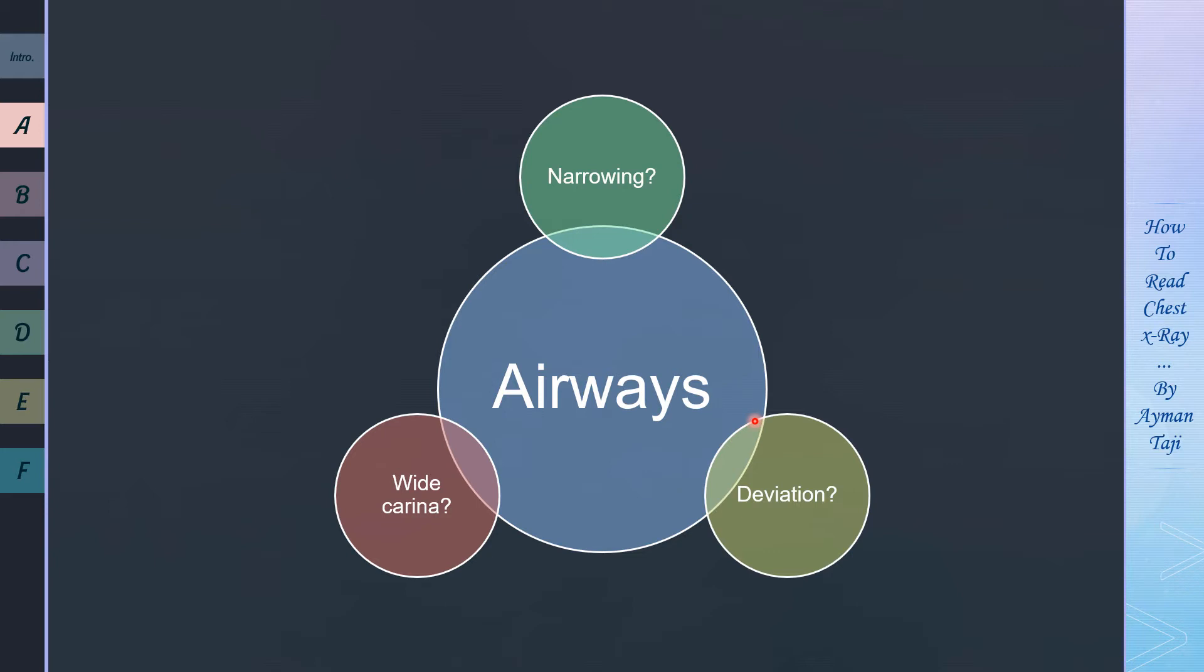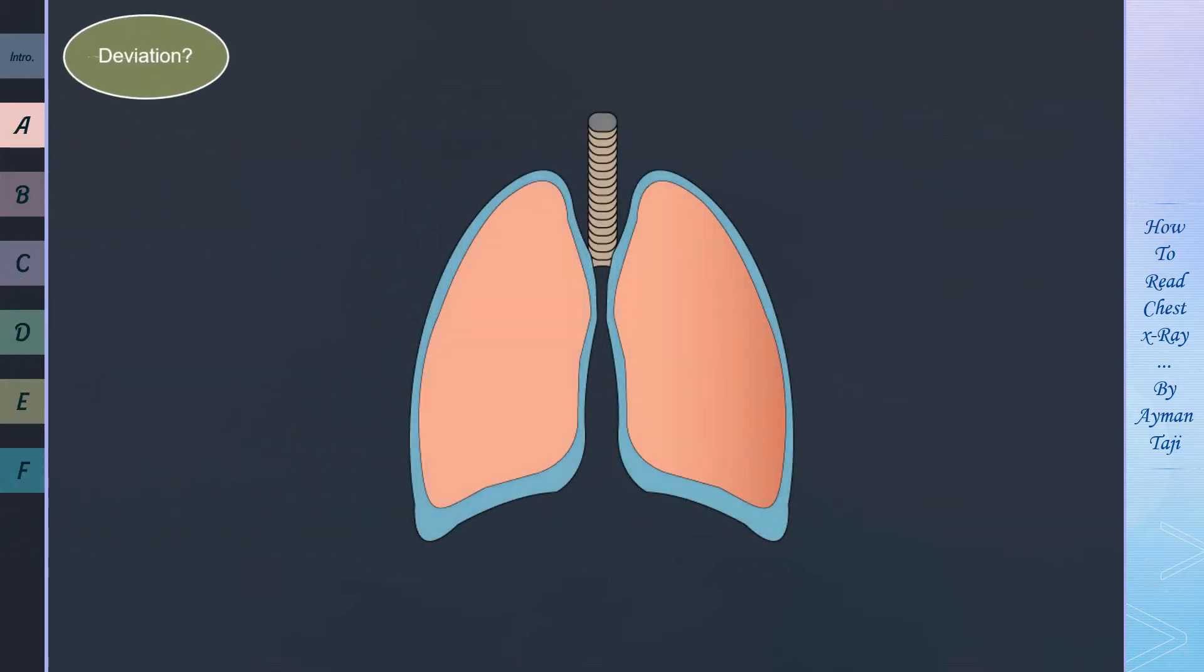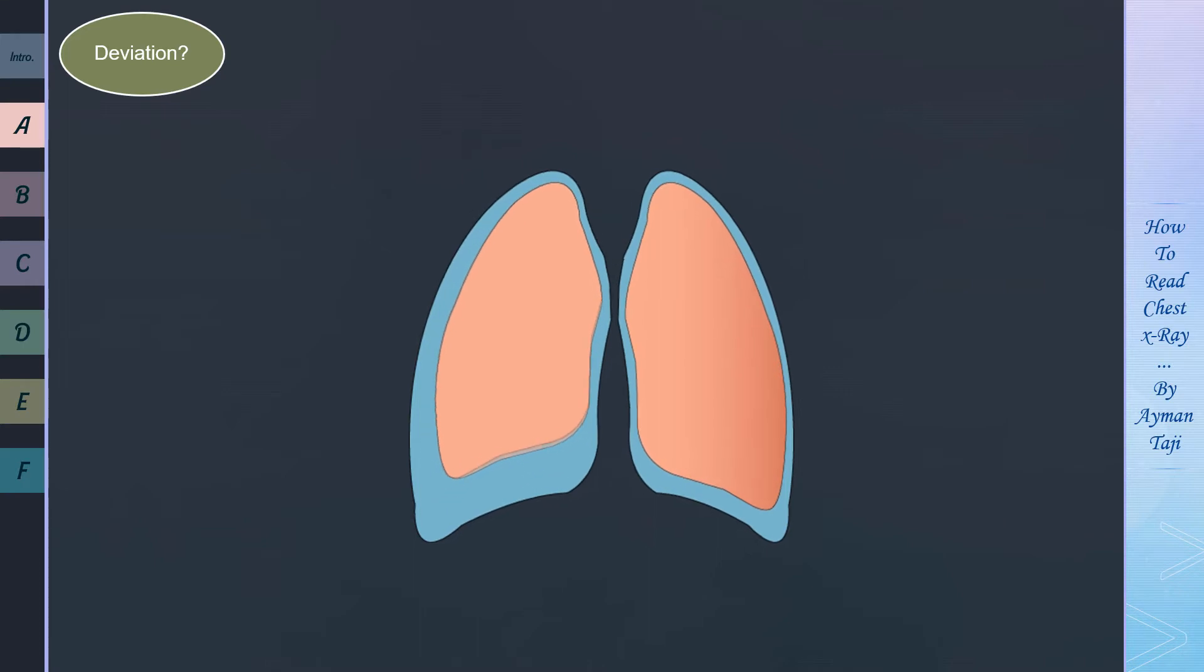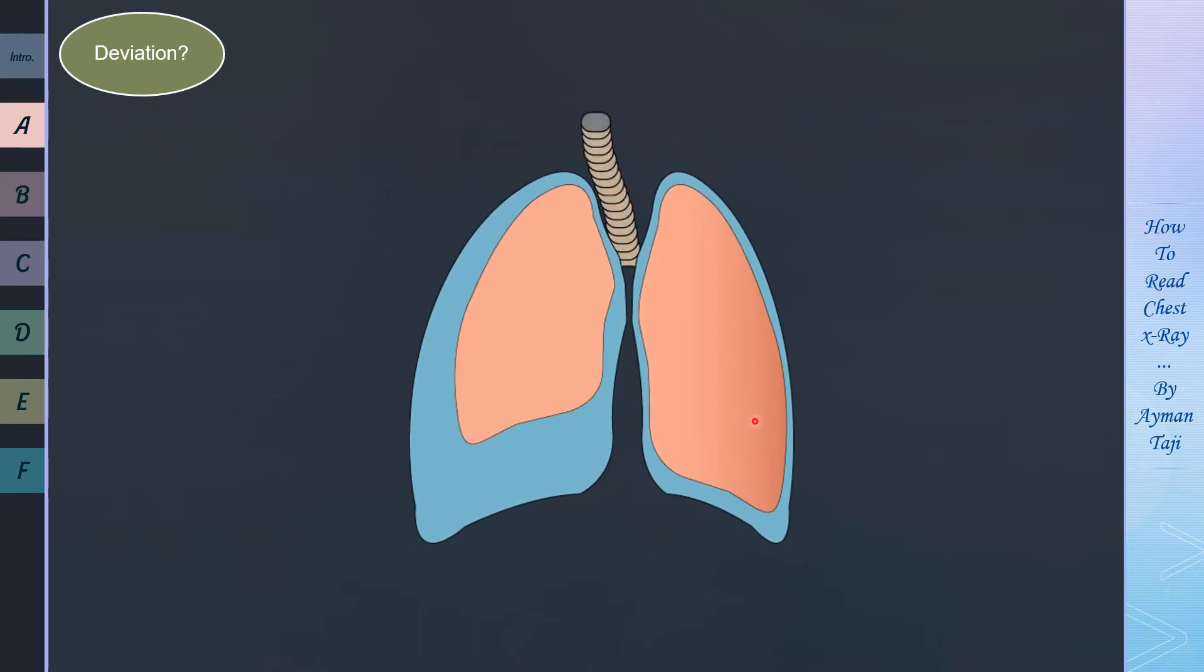Moving on to the second airway abnormality that can be seen on X-ray, which is airway deviation. Usually trachea is situated in a midline position. However, when tracheal deviation is present, the trachea will be displaced in the direction of less pressure, meaning that if one side of the chest cavity has an increase in pressure, let's say the right side here, then the trachea will shift towards the opposite one.